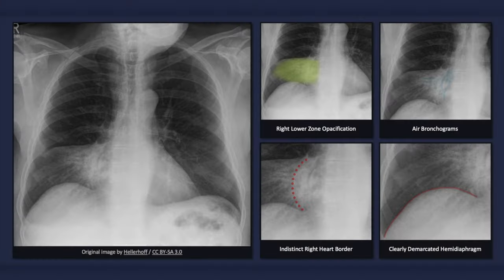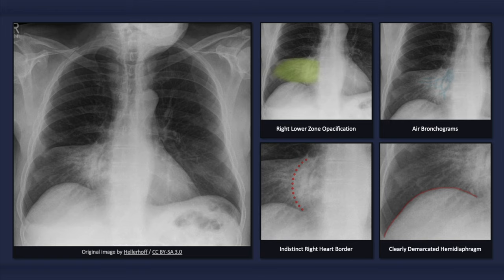On an x-ray depicting right middle lobe pneumonia, we would expect to see right lower zone opacification with air bronchograms and an indistinct right heart border, but with a clearly demarcated right hemidiaphragm. Unless there is coinciding atelectasis, there is usually no loss of lung volume. Keep in mind that radiographic evidence of pneumonia can worsen during the first few days of treatment and take several weeks to completely resolve.